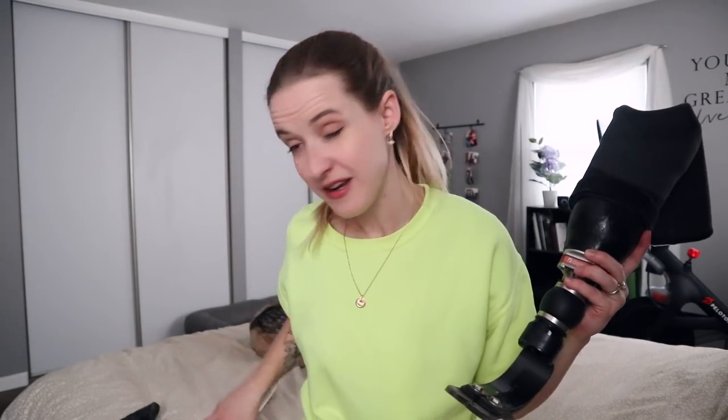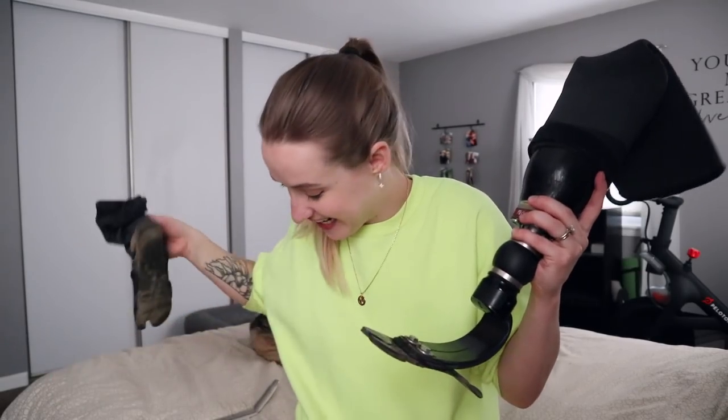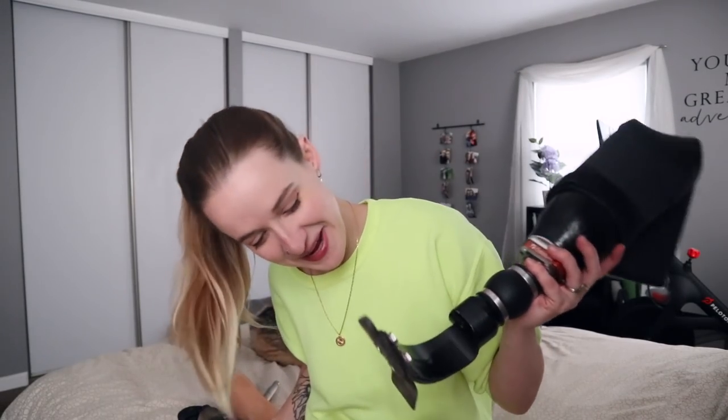This is a Kevlar sock. The carbon fiber actual foot — this right here is what actually allows me to walk. It's actually really cool. You may recognize the look and the shape from the running blade — it's just this curved carbon fiber. It has the split toe here, which serves a couple different purposes: first, it allows for more back and forth movement, and secondly, it makes it so that I can wear split toe shoes if I felt so inclined. Now, because this is carbon fiber, it would eat its way through the foot shell in a heartbeat. So this Kevlar sock has been on it for a year and a half, protecting my foot shell from the actual mechanics of the foot — the metal pieces, the carbon fiber pieces. I swear I even washed this off and it's still gross.